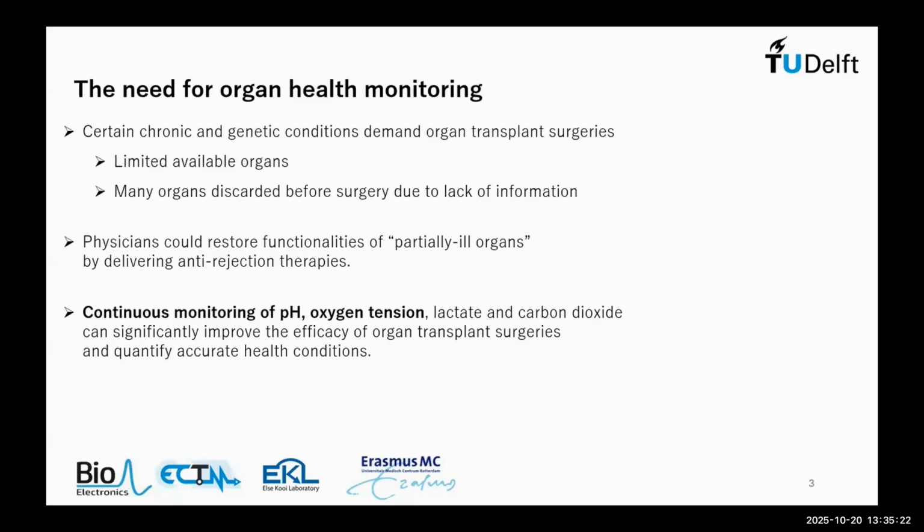We have a different approach now. This is from Erasmus Medical Center. Instead of putting it in a cool box, put it in an incubator, give it everything it needs, and do the measurements on that. In particular, we're focusing now on pH and oxygen, but lactate and carbon dioxide are things we're also thinking of. In this case, we have more time to do measurements, and we can be better sure that the organ is good.